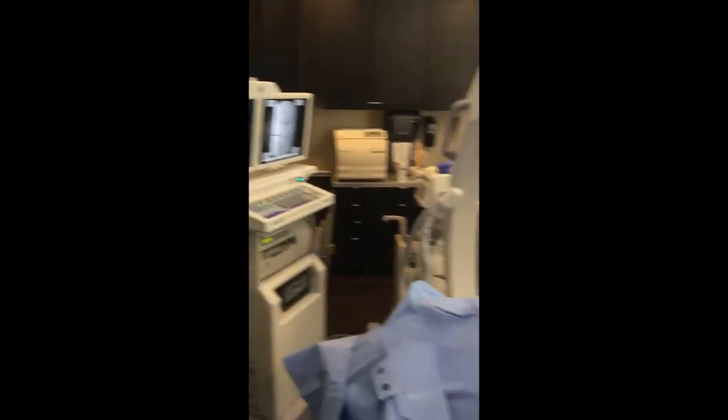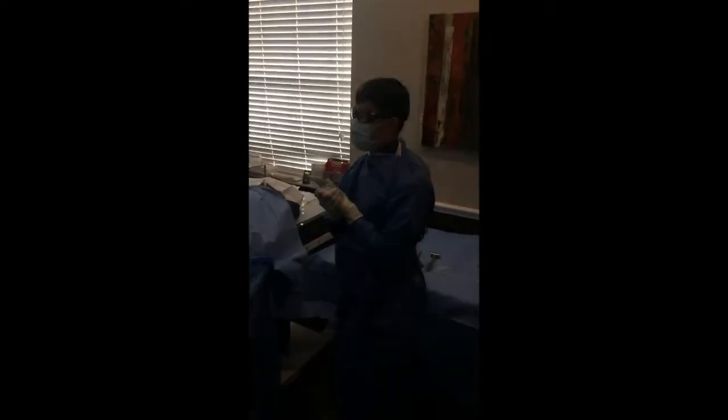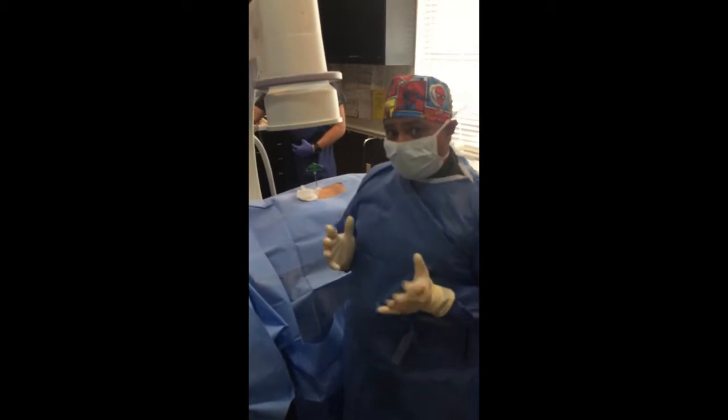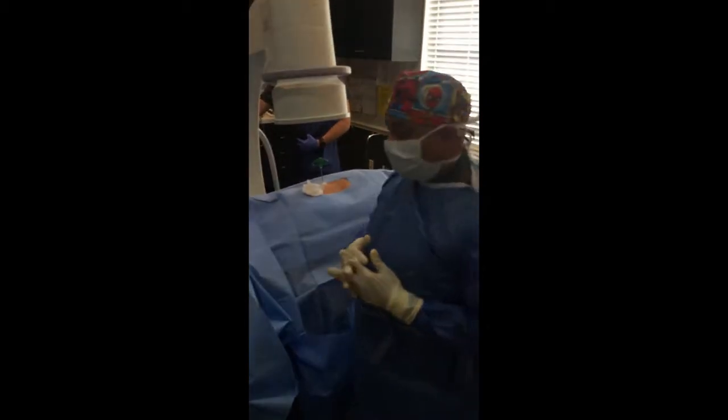We're here with our USF fellow, Dr. Eduardo Chen, teaching as well, and the patient has been kind enough to let us tape her. As we go through this, we'll give you increments of the procedure as we advance the needle and so forth.